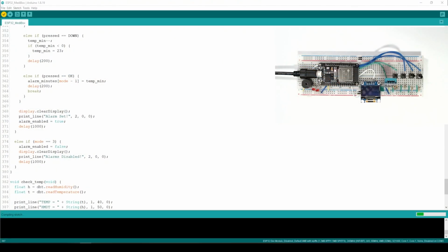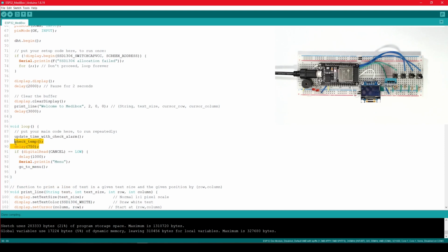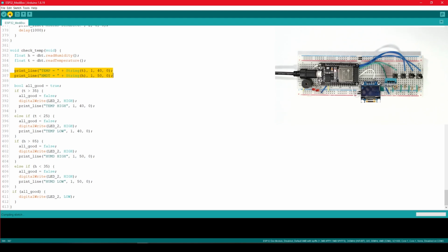Now, based on the observations of the breadboard testing, I have decided to make some improvements. Here you can see that the time is updating at an unnecessary rate. So I have added these 2 lines into my void loop function to update the time with the delay. Also, I have added 2 lines of code to print the temperature and humidity on the OLED display as well. Now I will upload my code.